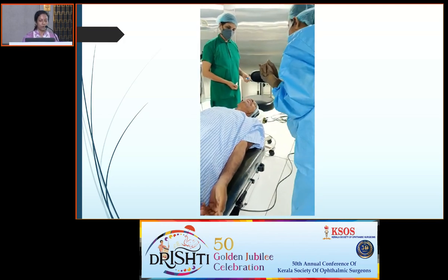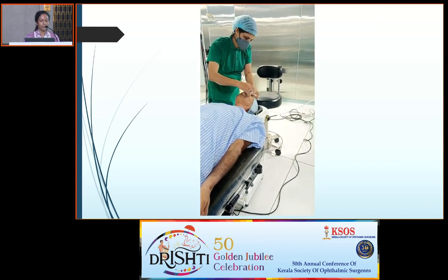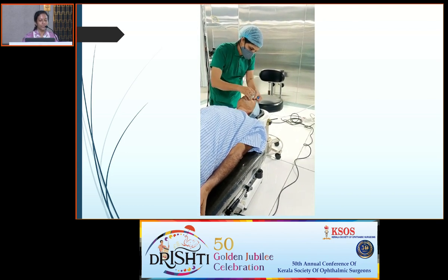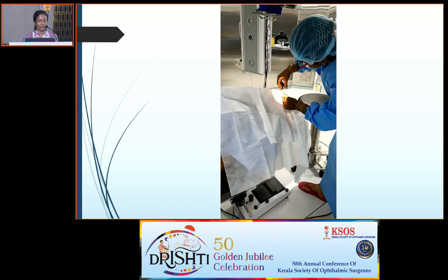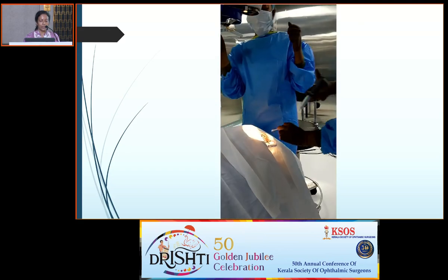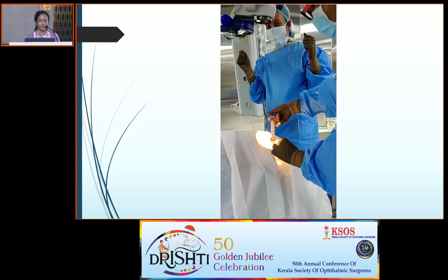Now, the patient is brought in. I confirm with the patient which eye is to be injected. As you can see, he had pointed to his left eye. Now, the sister puts a drop of paracaine, followed by a drop of povidone and gives it a contact period of 2 minutes. Once everything is ready, scrubbing is done. The draping is done. Place a speculum. And once a speculum is placed, the sister gives a thorough wash to remove the excess of betadine.